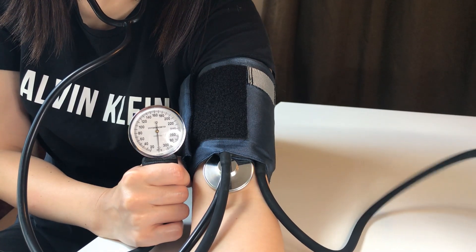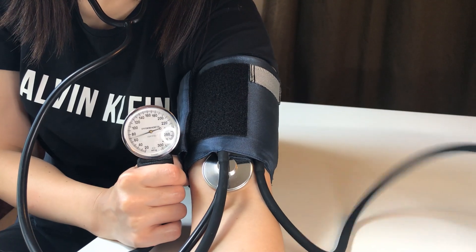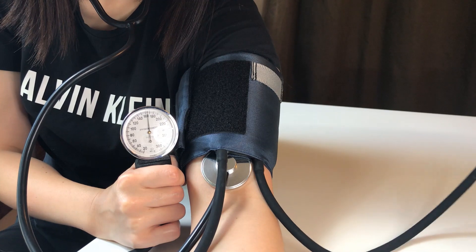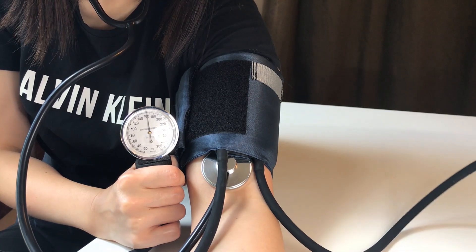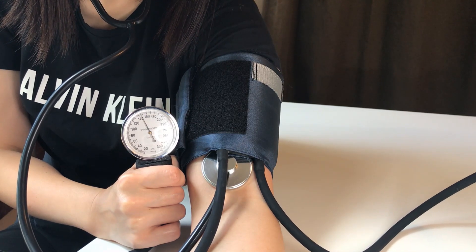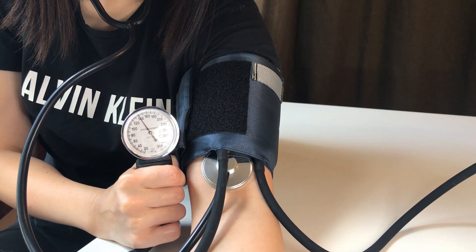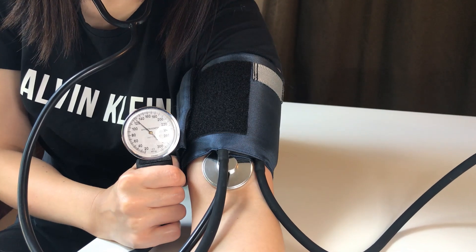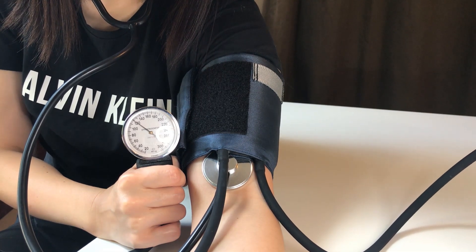The cuff is inflating — you can see that dial going up — and now it's going to go up to about 160. If I leave it alone it'll stabilize. Now I'm going to slowly let out the air. Notice how the dial is moving pretty steadily down, and when it gets to about 110 or so, I've already tested her so I know where it'll start jiggling.